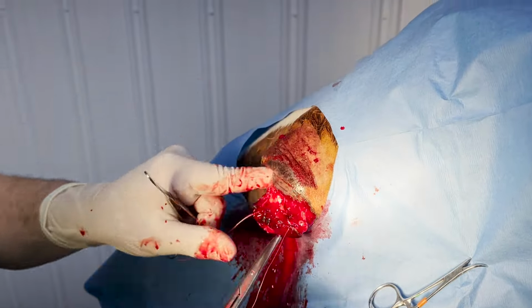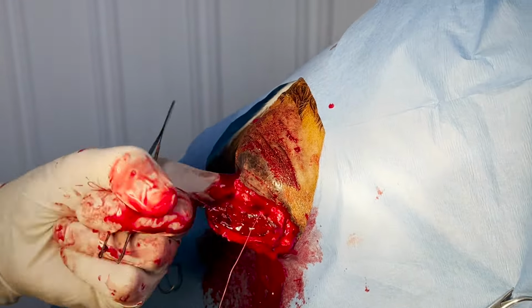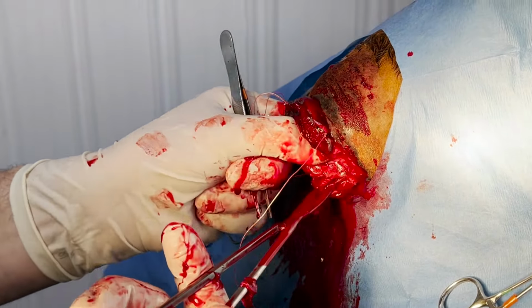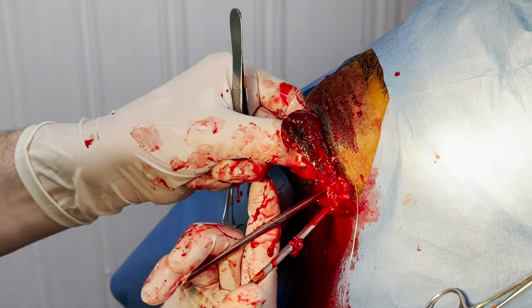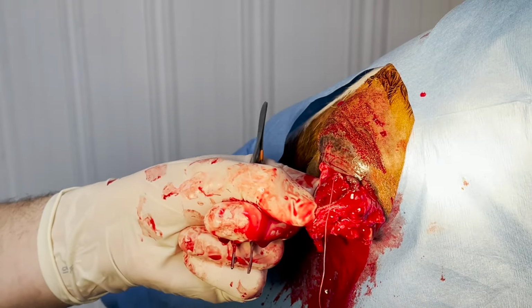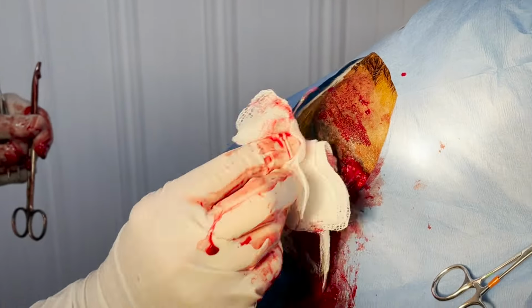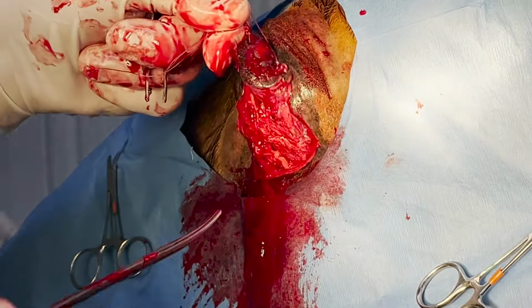Lots of hemorrhage with these surgeries, especially these ones that have been going on for a while. Like I said, that chronic inflammation. You get lots of blood supply there, and that's one reason faces heal so fast: it's all that circulation to the head. So it looks like a lot more blood than it is, to see if that optic nerve's actually blocked.